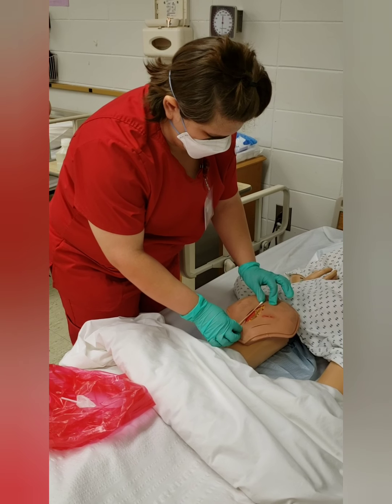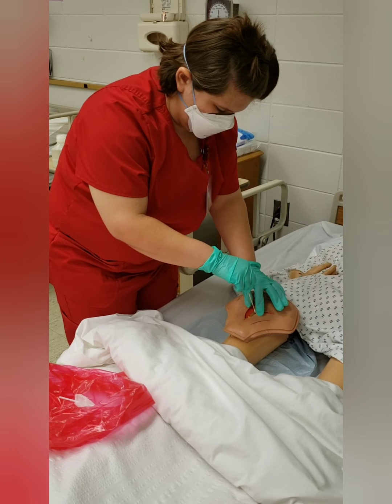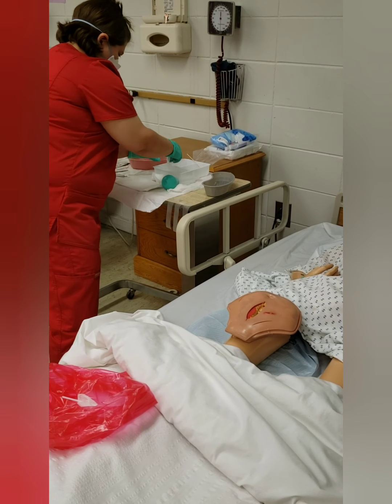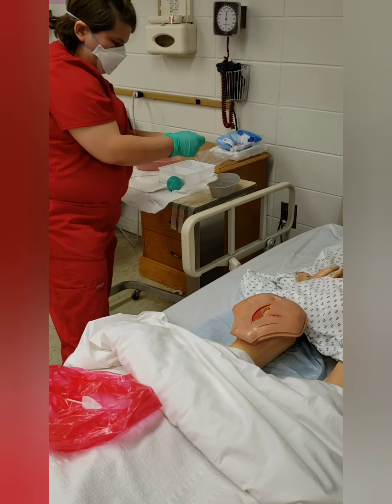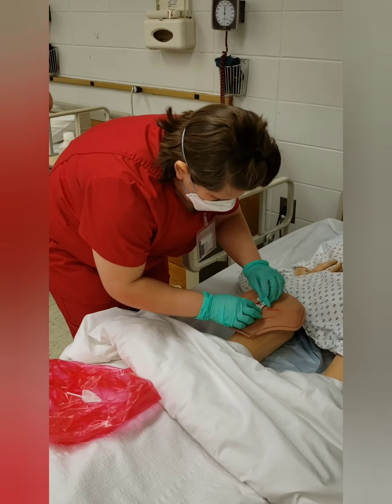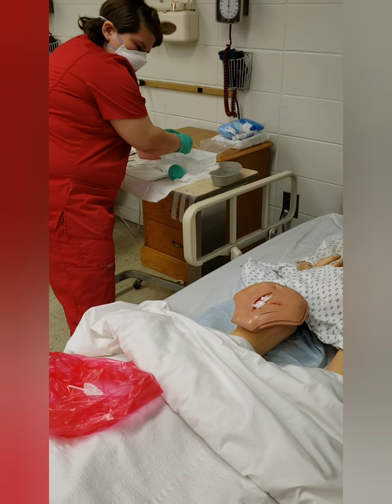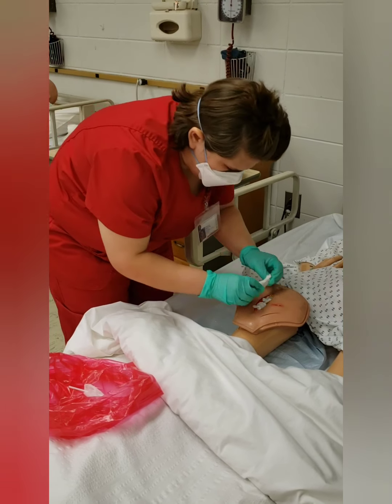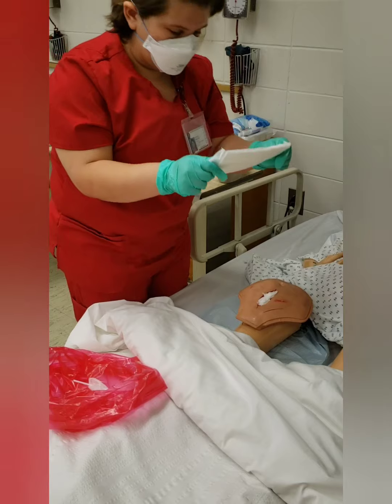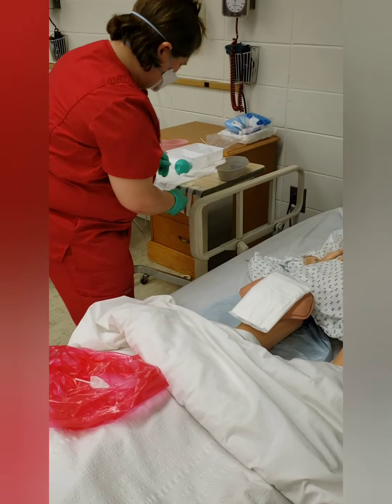We are going to measure the length, width, and depth of the wound. We will document this later. I've used sterilized water, and we are going to wet the new gauze and fluff the gauze. We're going to place the gauze into the wound. I'm going to place an ABD pad over the gauze, and then I'm going to apply tape.